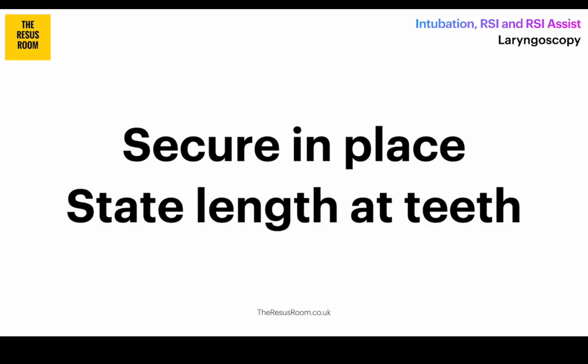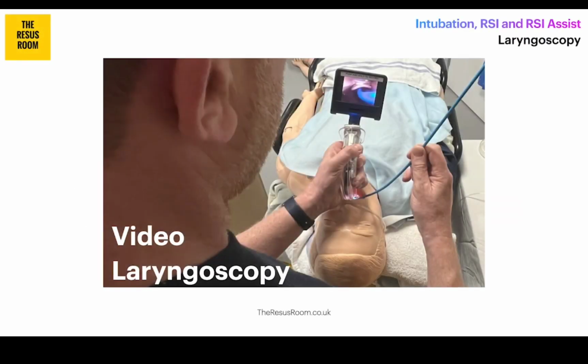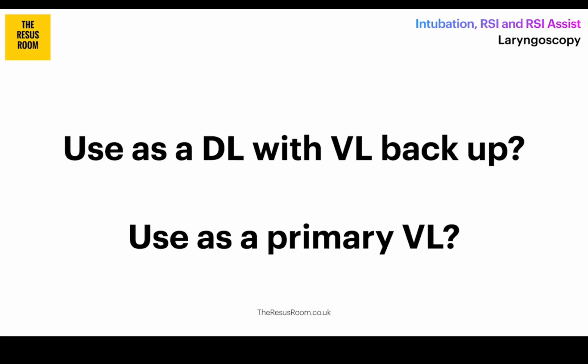So that's a bit about direct laryngoscopy, but what about video? And we're talking here, as I said, about a standard geometry video laryngoscope, so not one that's got a very significant and exaggerated curve on it. That is a different talk completely. Well, essentially, the sequence is the same, but the way in which we use the equipment can differ.